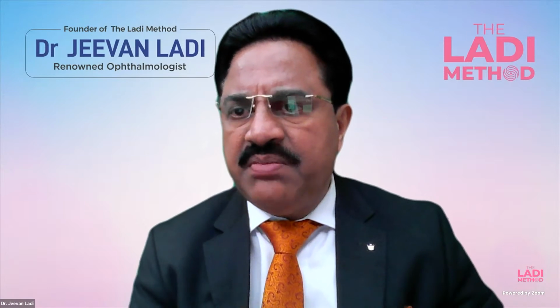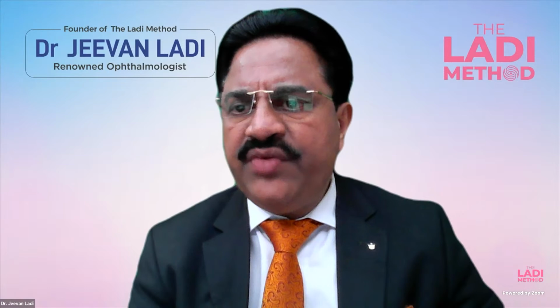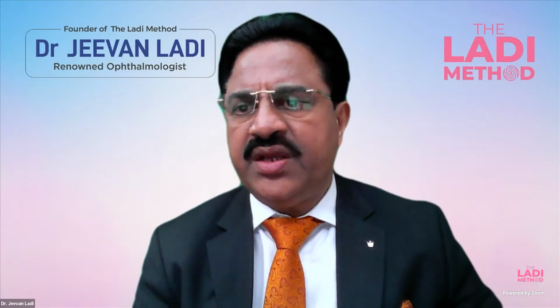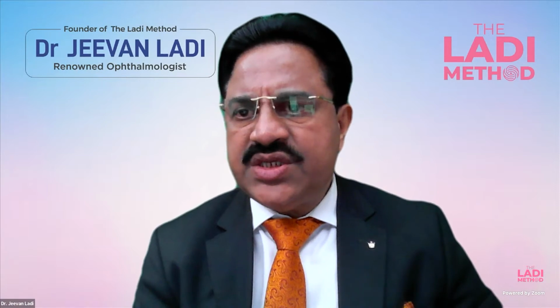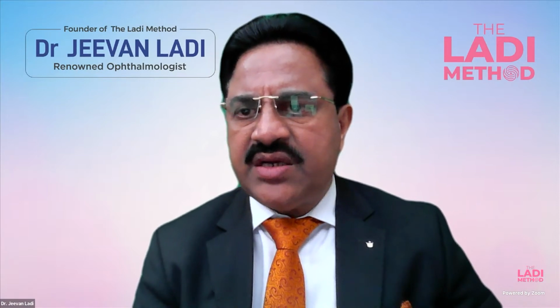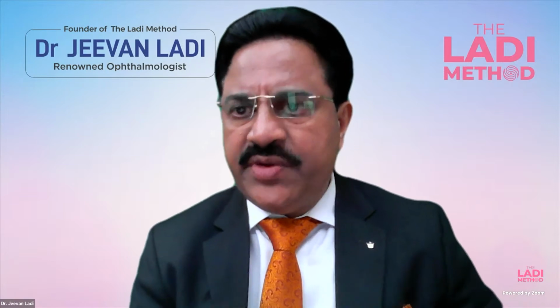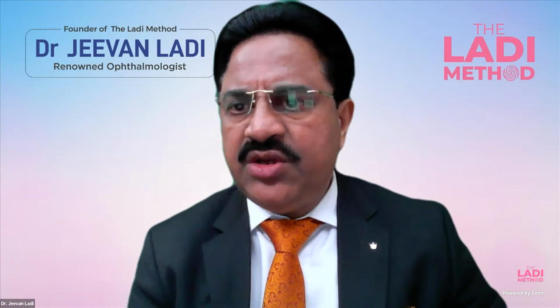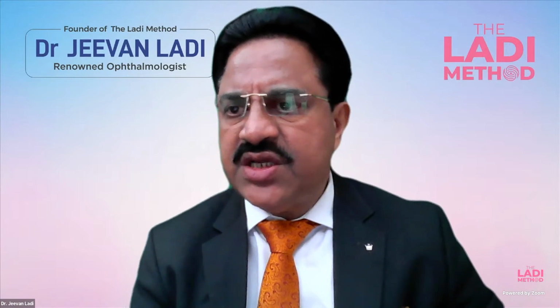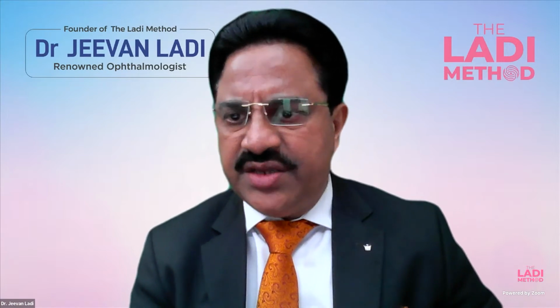Are you starting at the limbus? Or do you go 0.5 to 1 millimeter inside the clear cornea? So see your cases, at least 15 to 20, consistently taking the incision at the same place, which is convenient to you as a surgeon, and that will give you the SIA, that is the surgically induced astigmatism readings, which you can incorporate into studies.